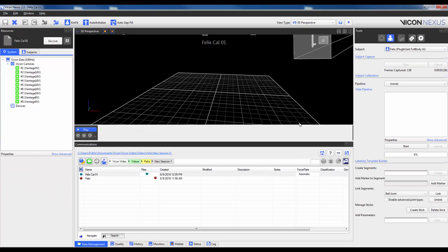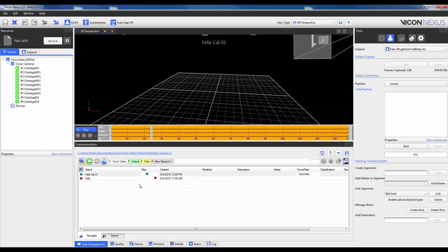You will see that as soon as I click Stop, the trial will actually appear in the Data Management and that it has switched from the Live to the Trial View. It has opened automatically. This is verified up here at the top where it no longer says Live but actually says the Trial FelixCal01.